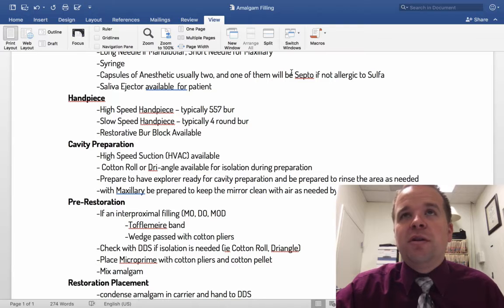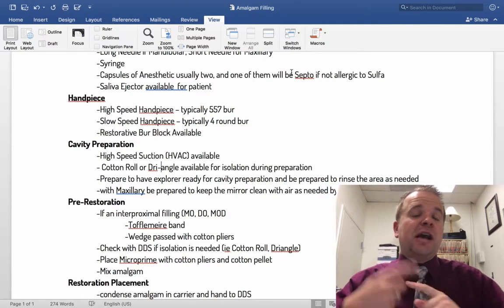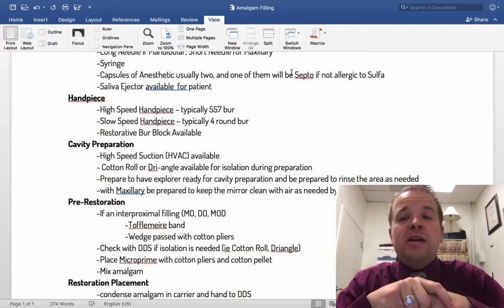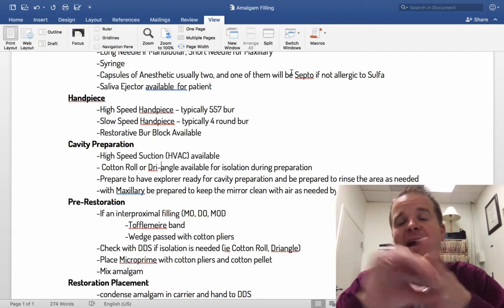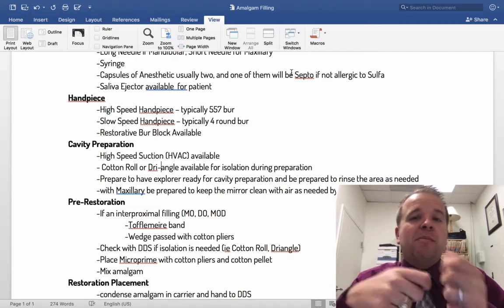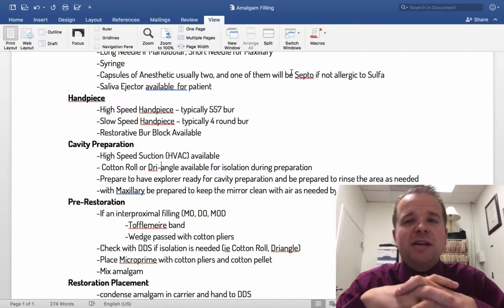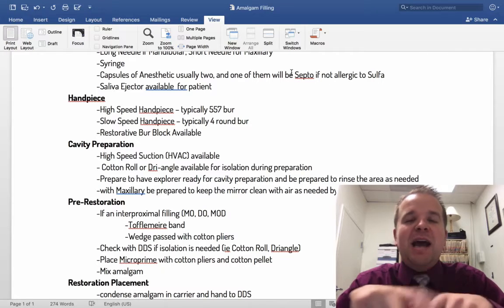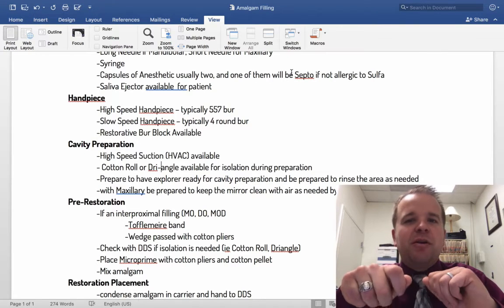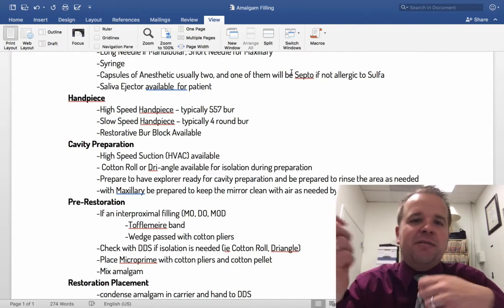At first, you'll want to make sure that you get either a lidocaine, which has a red ring on it, or you can do septo, which is usually articaine, and that has a gray ring on it. So you can get both of those out. Most docs like to stick with just one type of anesthetic. I like to shake it up and do a lot of different things, and you'll kind of learn the doctors as you go. But it's not a bad idea to have both of them out just to make sure that they have what they need when they need it, so you don't have to go back and get something different.